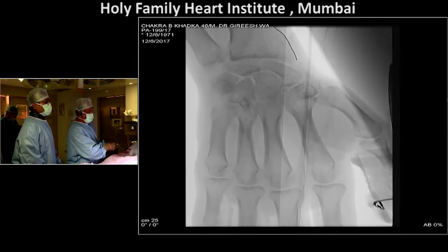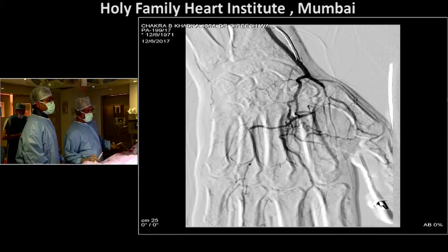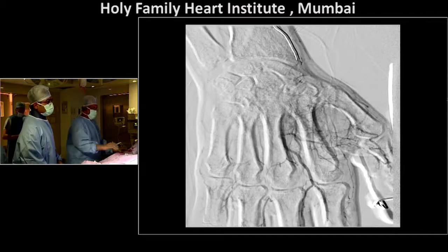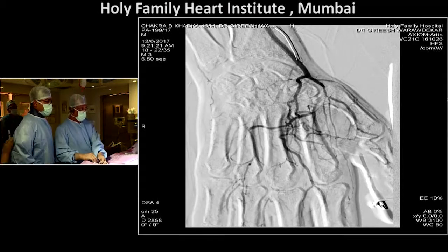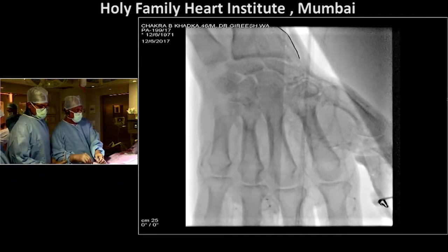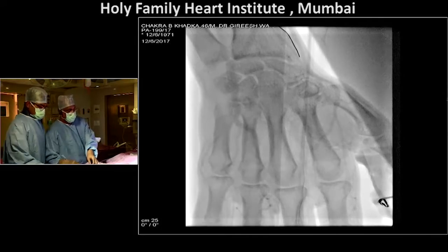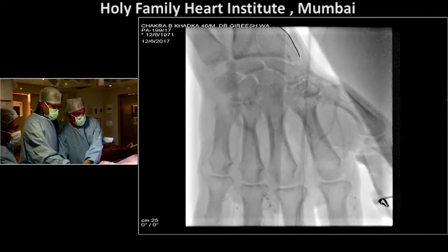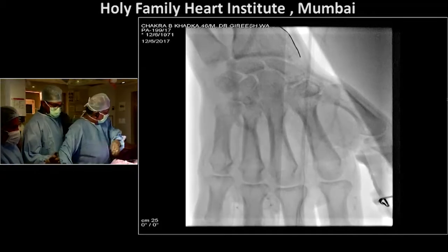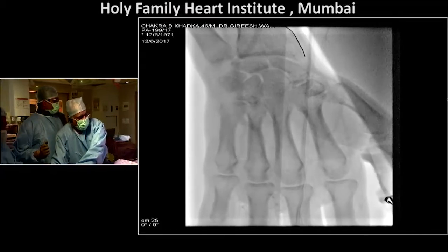This, across the joint, is always a challenge for interventionists. What happens in these patients is you can't use stents, especially at the elbow where there is an acute bend. So you have a problem there. What about drug-coated balloons? That's a good point I want to make. In a case like this, would you suggest drug-coated balloons? Girish, your idea on drug-coated balloon, do you have it in mind or have you totally negated it?